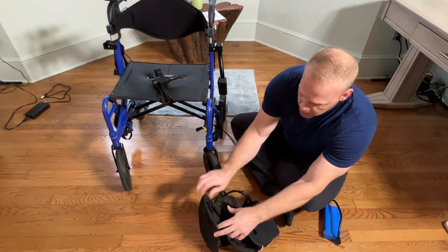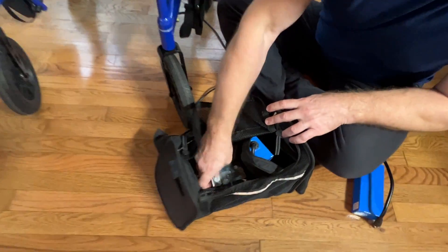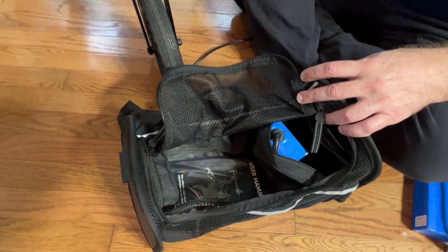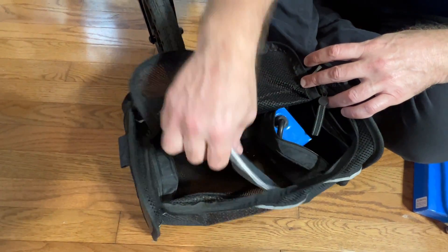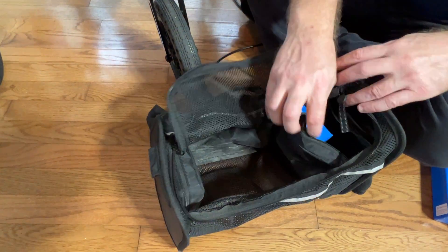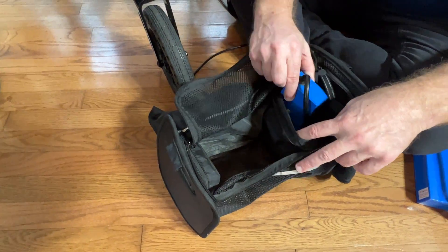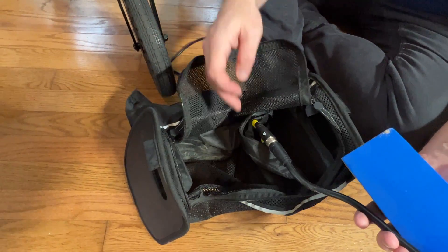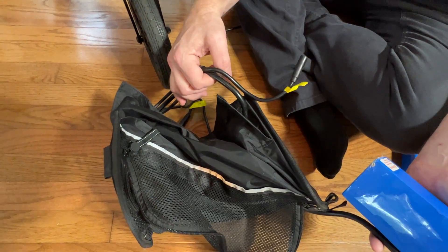It's the under-seat basket and when you get your Wheelator you do get a tool kit. You also have your instruction manual, and we have a pouch here. You can see the pouch basically contains a battery that is going to connect to the machine.